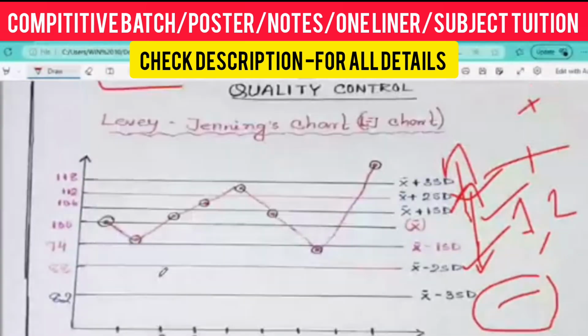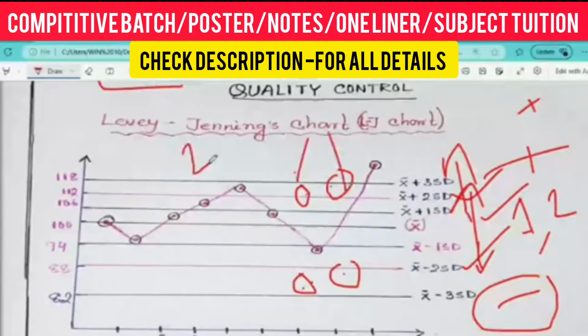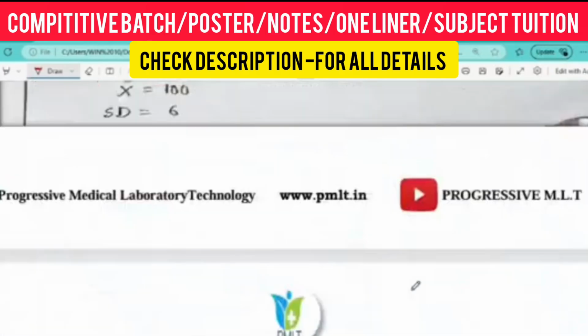If I am taking repeated 2s results, that might be on the positive side of 2s or on the negative side of 2s. Getting my point? If I am getting two repeated results, and 2s means 2 standard deviation, on either side, positive or negative, we cannot take the result. That is rejected. That is the third rule. Understood, everyone? Yes, sir. So we have covered the third rule also.